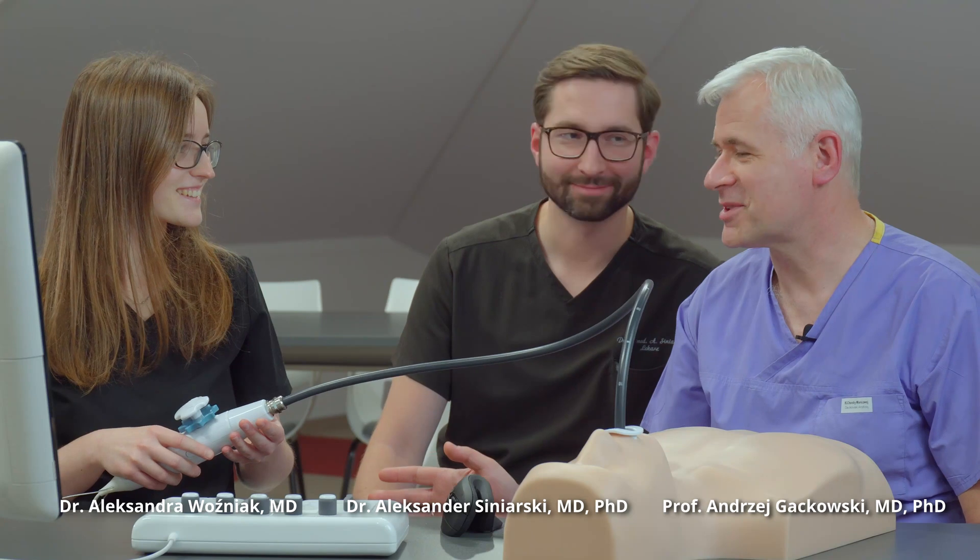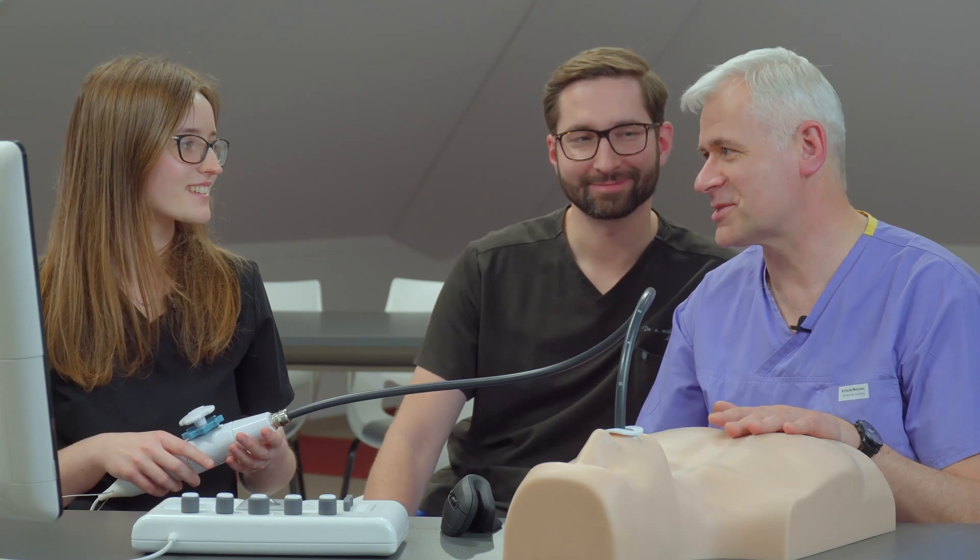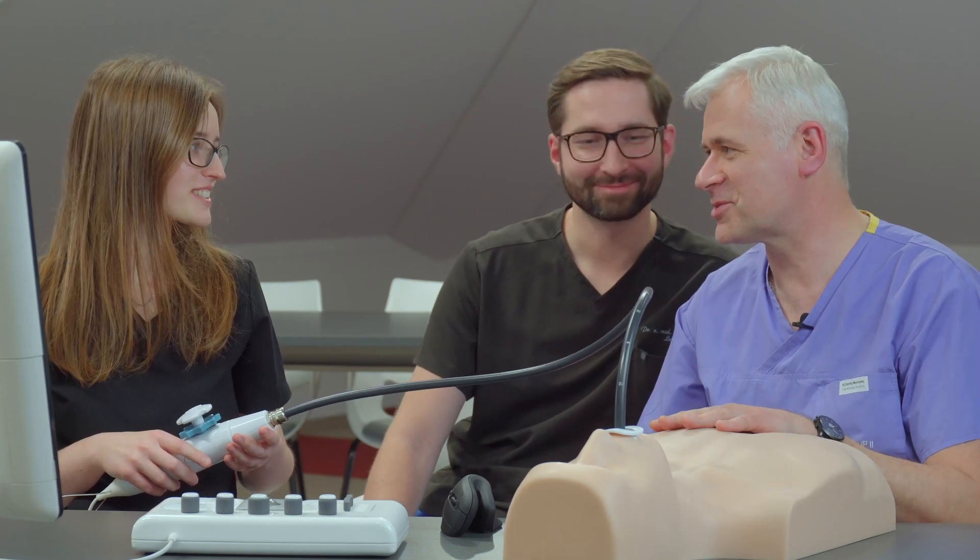You are the very new resident, right? So you just came for the training and you have never done even the transthoracic echo, right? No, never. Only by myself. But it was just the first attempt and you have for sure never done any transesophageal. Never, it's the first time.